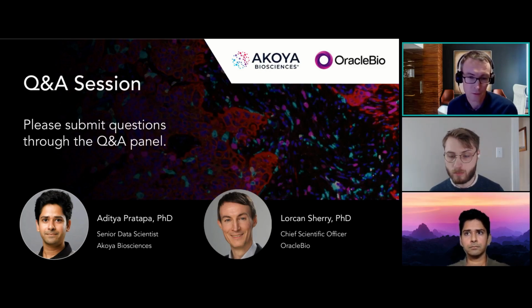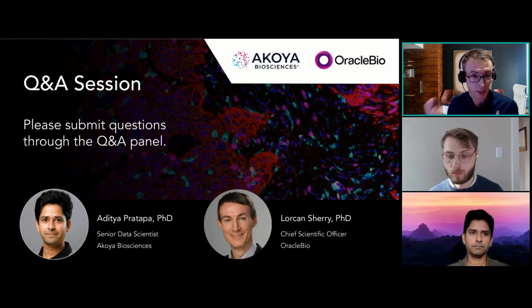And I think here there's certainly an opportunity for AI to be incorporated to support some adaptive thresholding, so that the AI is trained to recognize how positive staining looks in a low exposure background or in a high exposure background. What is positive staining? Can that be detected? And also in areas where there's maybe non-specific staining or things like that.